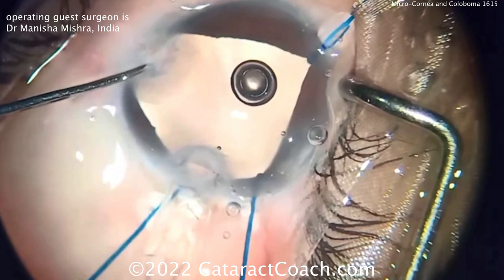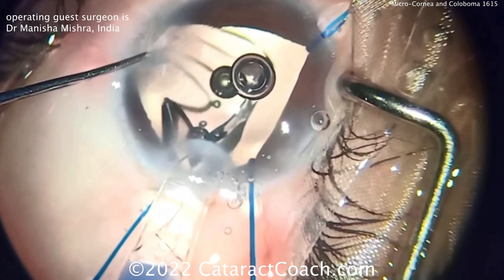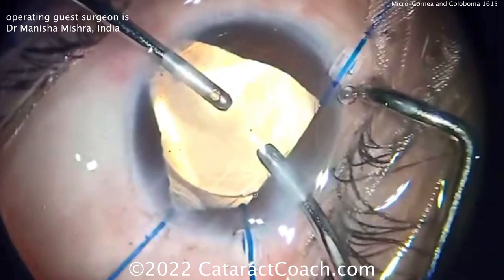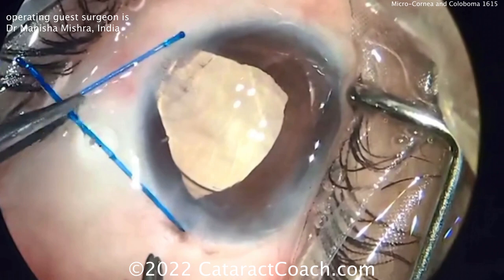Here comes the lens being delivered — looks like a single-piece acrylic lens, probably standard size, but it's going to look absolutely humongous in this eye. There's the leading haptic, here comes the optic — probably a six-millimeter optic. You can see what a tiny little eye this is. The capsular bag is also quite small. I like the idea of single-piece lenses because they're more flexible and able to fit into that tighter, smaller capsular bag.